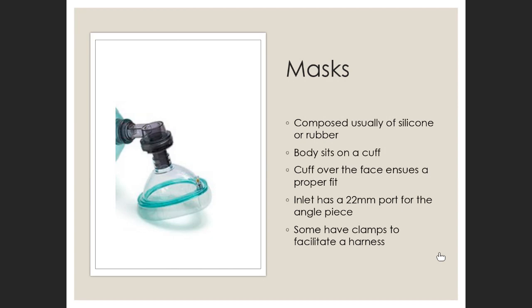Okay, all right. Carly, Miss Forrester, let's go. Laryngeal mask. Chad. I also say the laryngeal mask airway. All right. Chevon, let's go. I think the endotracheal tube. Okay. Christian. Laryngeal mask.